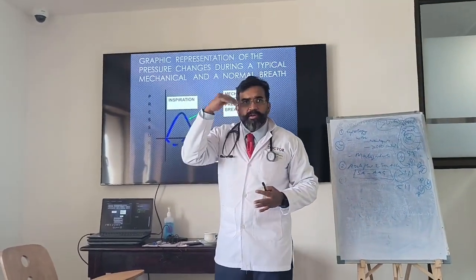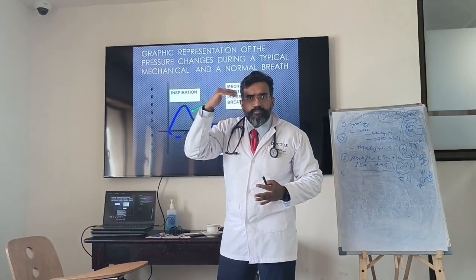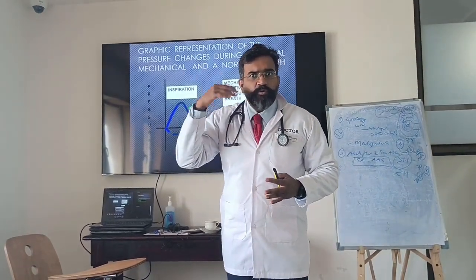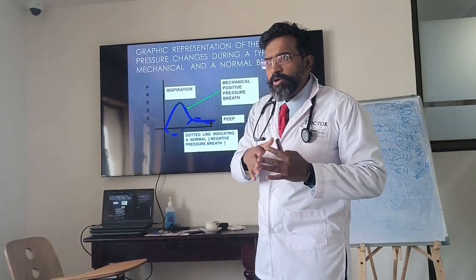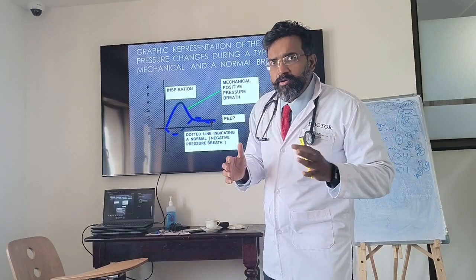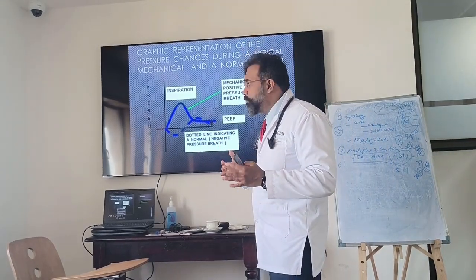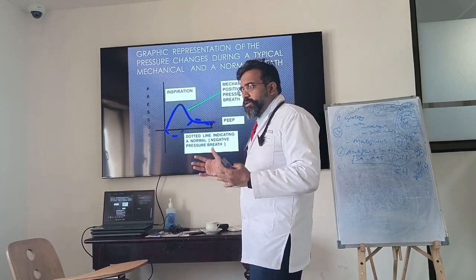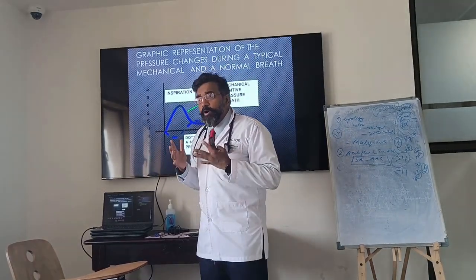Scalars are always pressure versus time, volume versus time, flow versus time. This is what you're going to see on your ventilator. You're going to see scalars. You may want to see loops if you are interested, but usually what is seen generally is scalars. So let us look at a scalar of spontaneous ventilation.